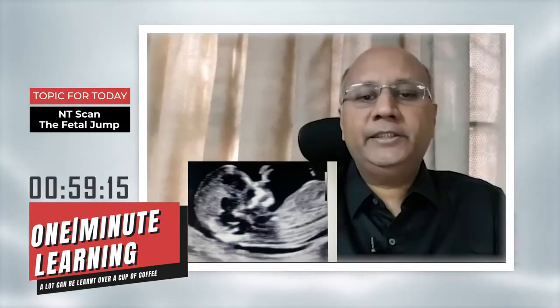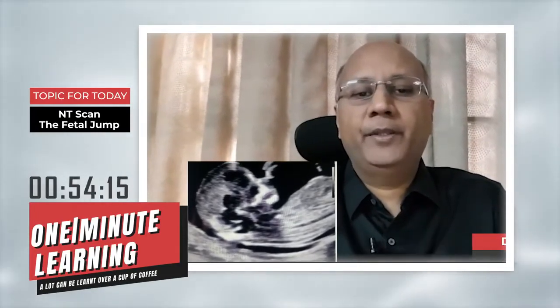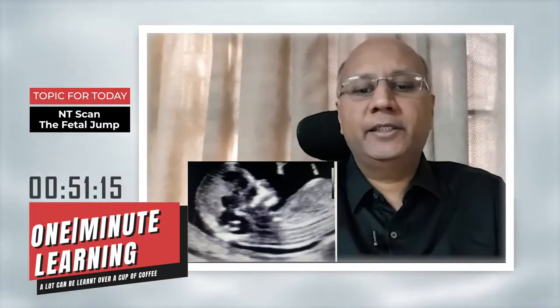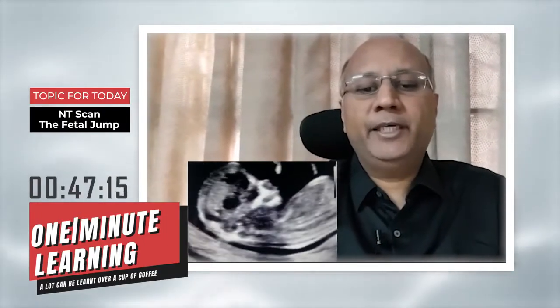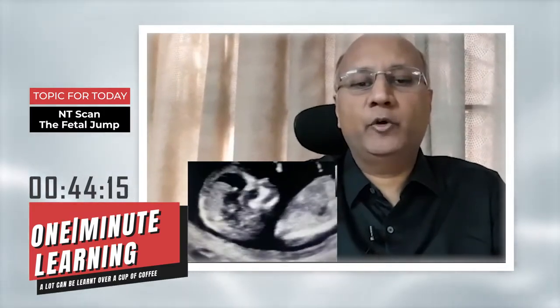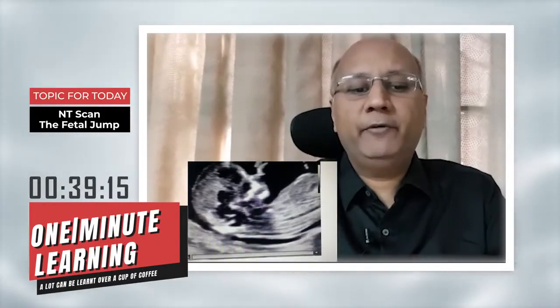This is an apt picture for measuring the NT in the mid-sagittal plane. One may wrongly measure this distance as the NT, which is actually the space behind the amnion and in between the amnion and chorion. In order to avoid the wrong measurement of this as NT, what we have to do is watch the cine.